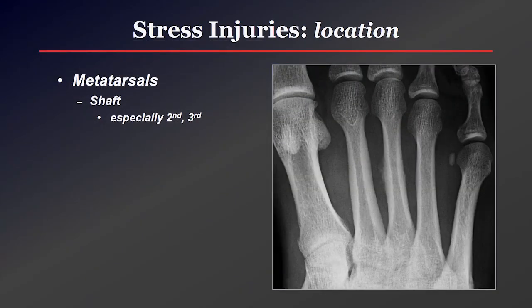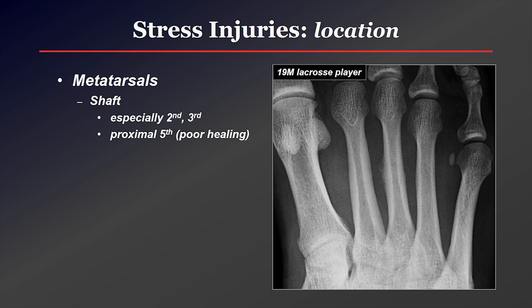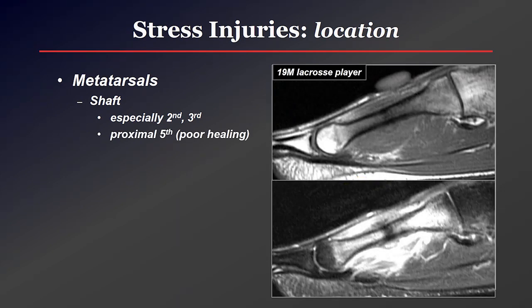The metatarsals are a very common location for stress fractures, especially the second and third. Note that the proximal fifth metatarsal, if fractured, is high risk because these tend not to heal very well, and occasionally surgeons will put a cannulated screw across it to help healing and prevent a more displaced fracture. Here in a 19-year-old lacrosse player, you see the typical periosteal reaction of a stress injury, and MR shows marrow edema, soft tissue edema, and a transverse low-signal developing fracture line.